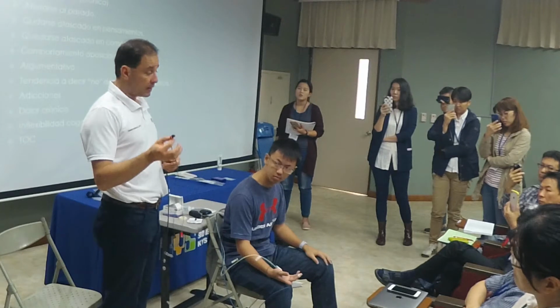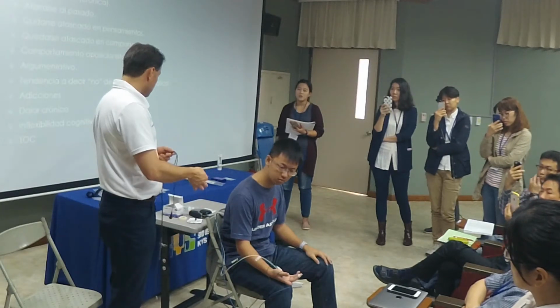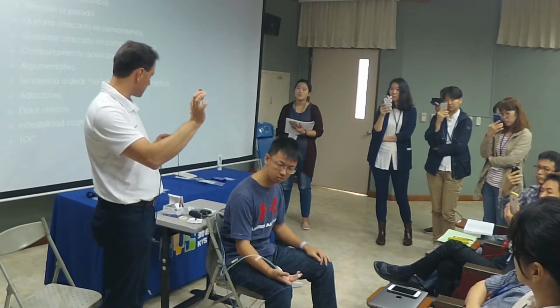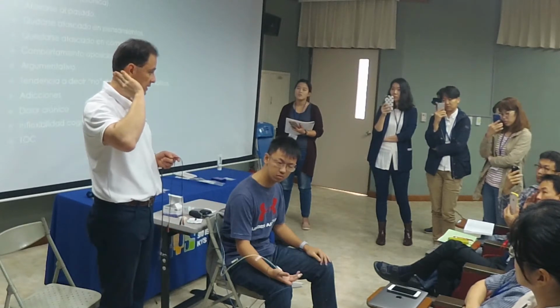It could be either one. The blacks could be the active, the reds could be the reference. Now, the way I like to teach it for practical purposes is red is the active, black is the reference. Okay, and the active is going to go on the left side, the reference on the right side.